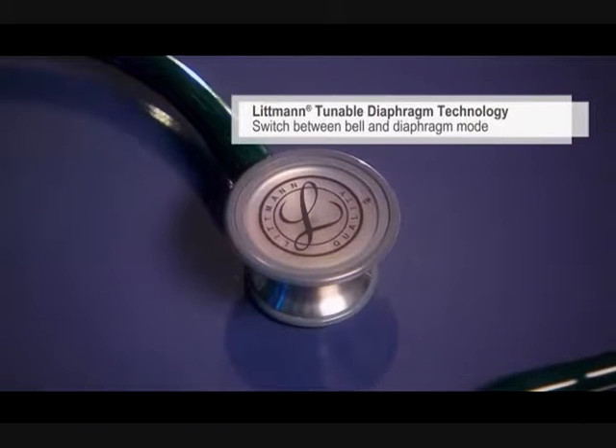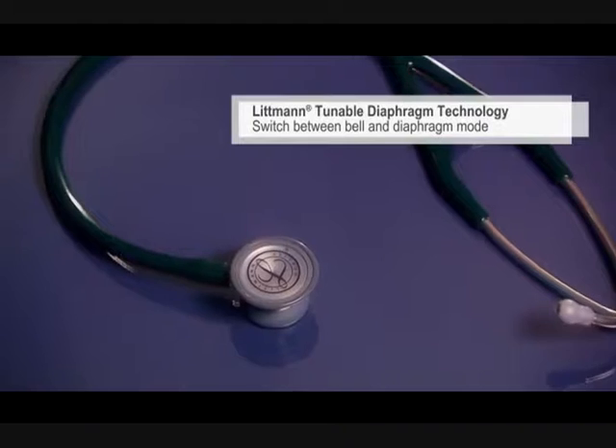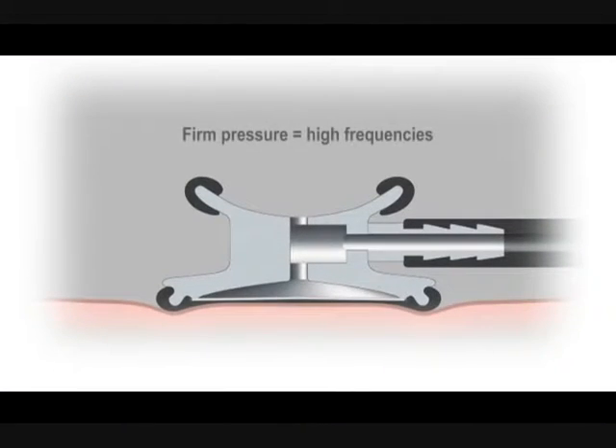It features our tunable diaphragm technology that lets you switch between the bell mode for low frequencies and diaphragm mode for high frequencies, simply by changing the pressure of the chest piece on the patient.